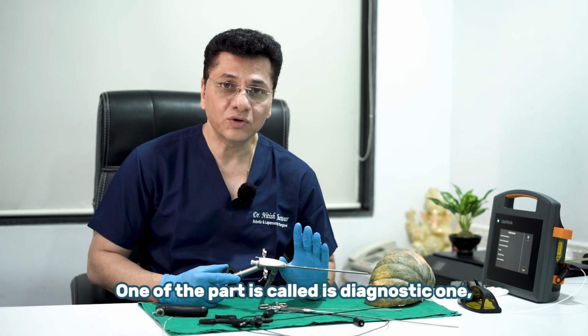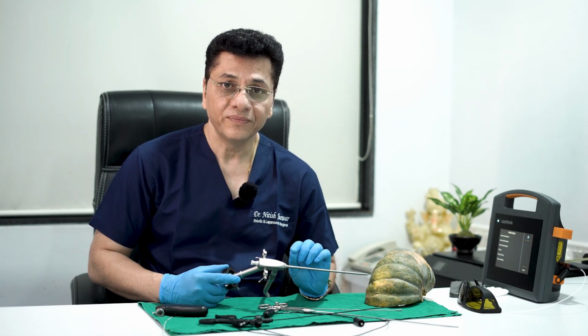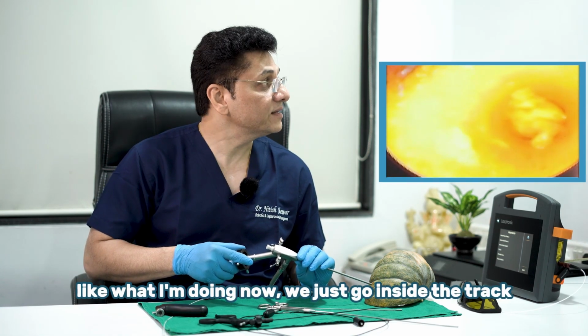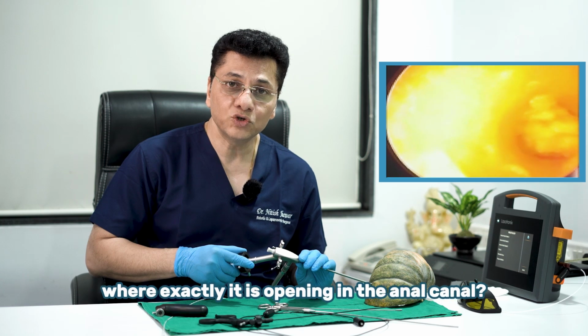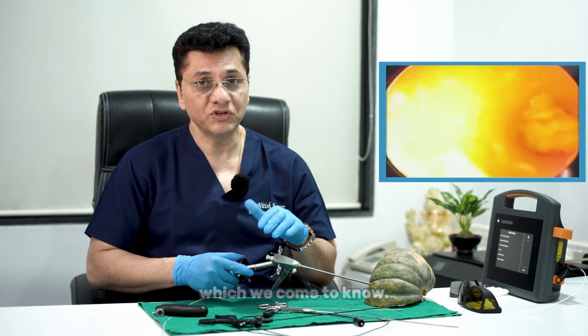One of the parts is called the diagnostic one, which is a fistulascopy. We put this scope inside the fistulous tract, like what I'm doing now. We'll just go inside the tract. We'll try to assess the tract, how deep it is. Are there any side branches? Where exactly is it opening in the anal canal? And that is the internal opening, which we come to know.